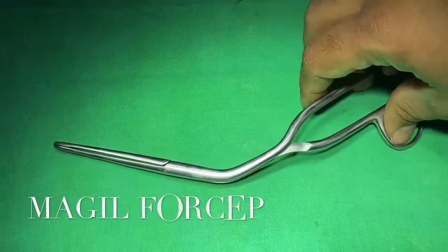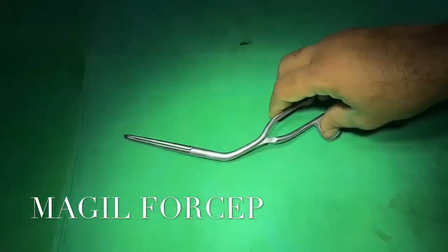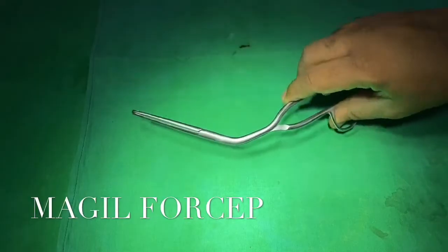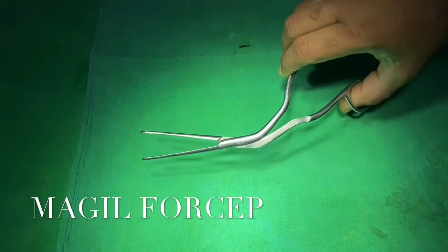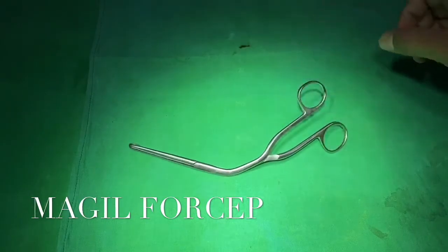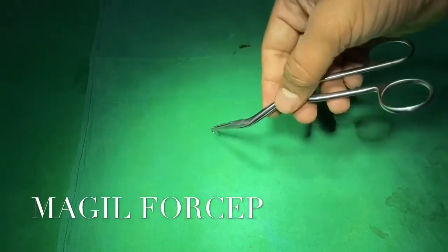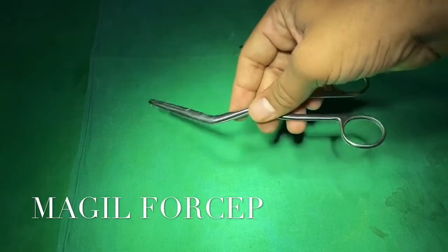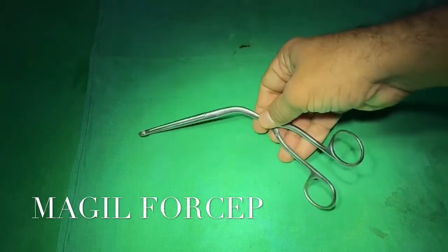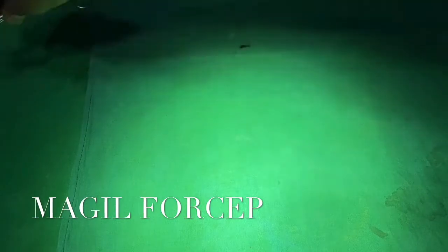This is Magill's forceps, named after Ewan Magill who was an Irish anesthetist. This instrument is used to guide the endotracheal tube into the larynx, a nasogastric tube into the esophagus under direct vision, and is also used to remove foreign bodies and for throat packing. This is the only instrument used exclusively with the right hand.